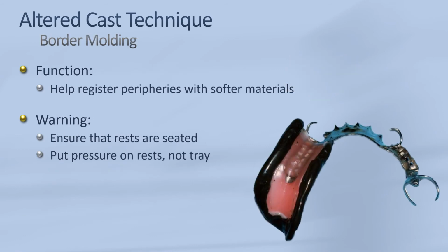Before taking the impression with the impression material, we need to ensure we have a good border. Therefore, we want to border mold with compound before taking that impression. Compound is ideal to do so, as the material will give you some time before setting, so you can move the cheeks and the tongue to border mold that region. It is easy to correct by adding or removing material, whereas border molding with a polymerizing material will not offer that advantage.